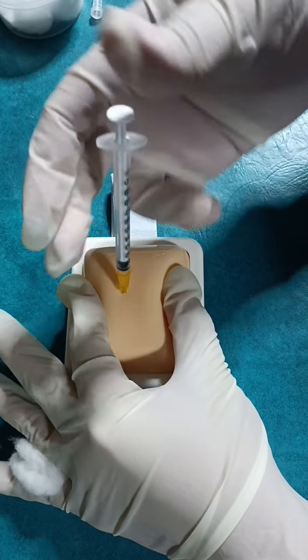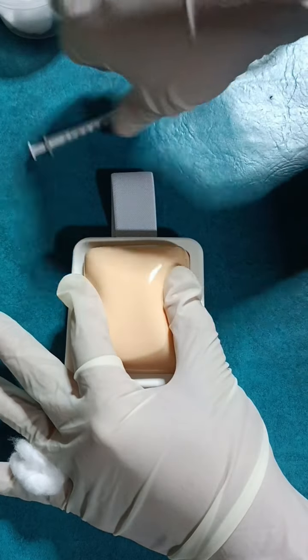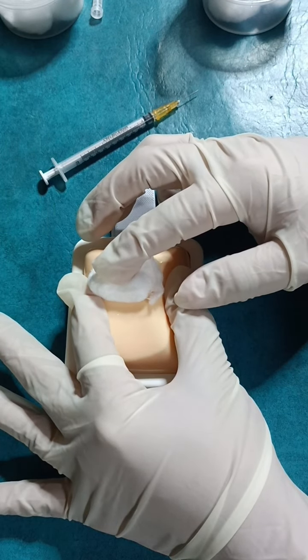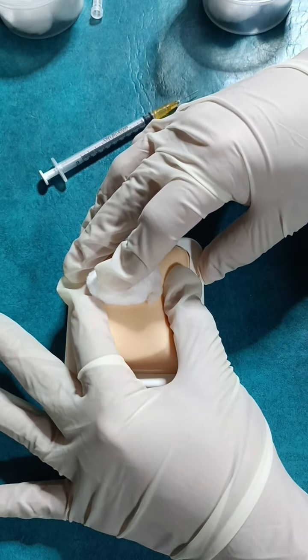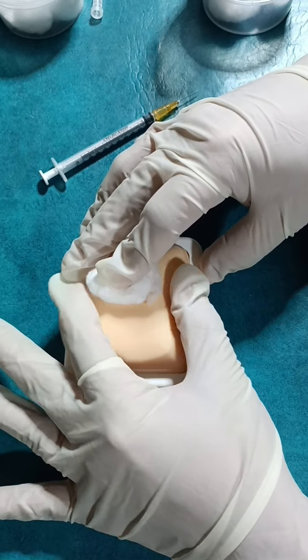Inject, and then pull out at the same angle we inserted. Then apply the dry cotton ball. Do not massage the area. Apply gentle pressure on the area.